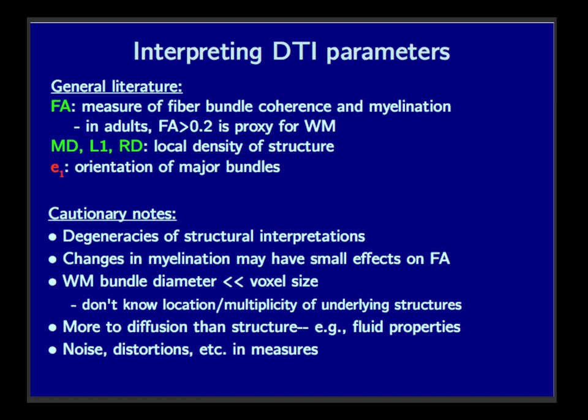And also there's more to diffusion than just structure. So all I focused on is how the straws are arranged or something like that. But with diffusion, there's a reason you don't just put a tea bag into a jar of honey and try to make tea, right?